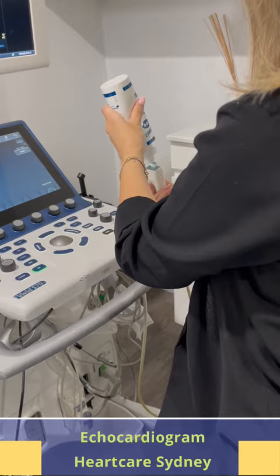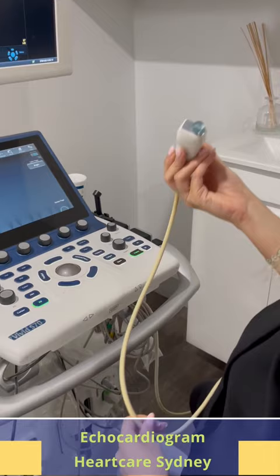Moving the transducer over the chest generates images of the heart on a monitor, allowing the cardiologist to evaluate the heart structure, function, and blood flow in real time.